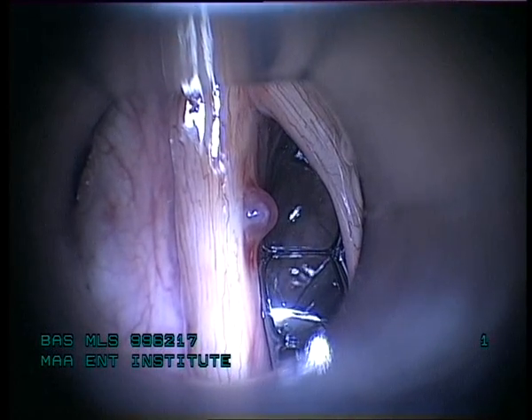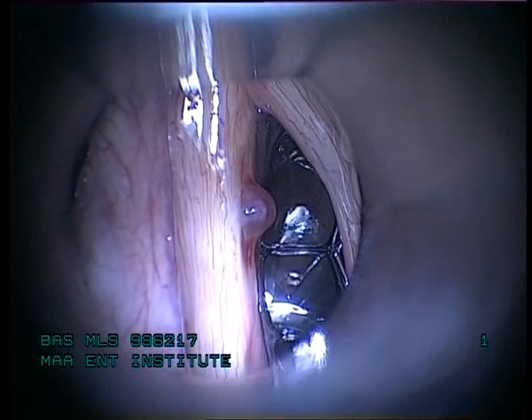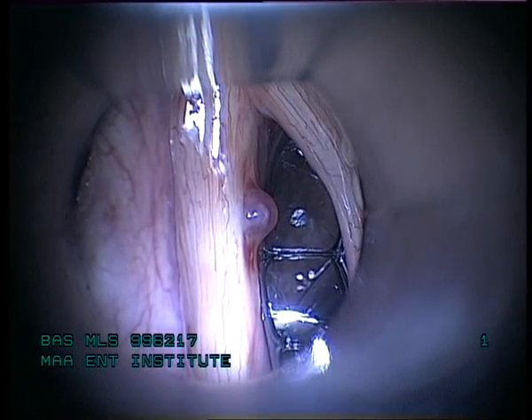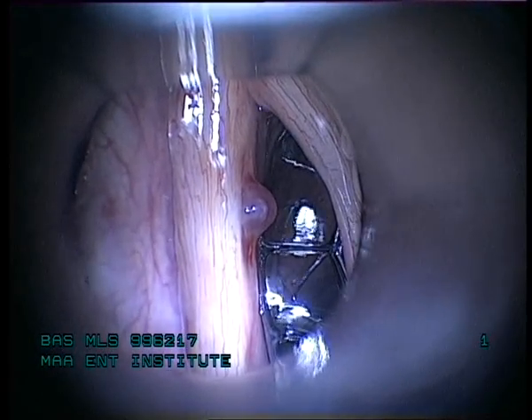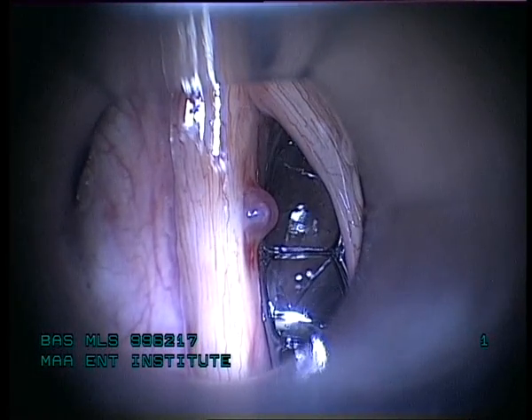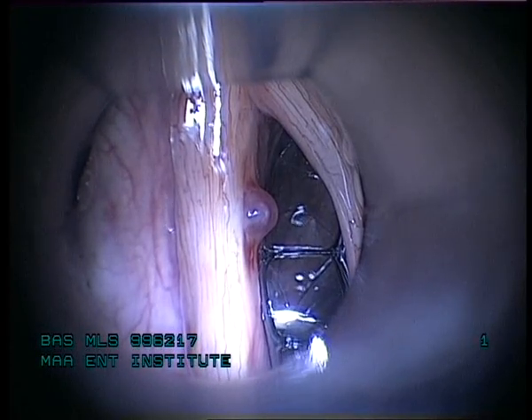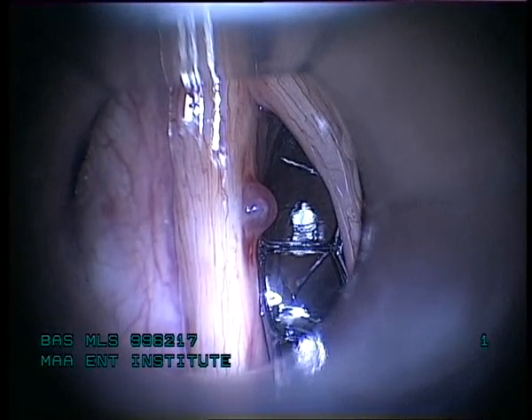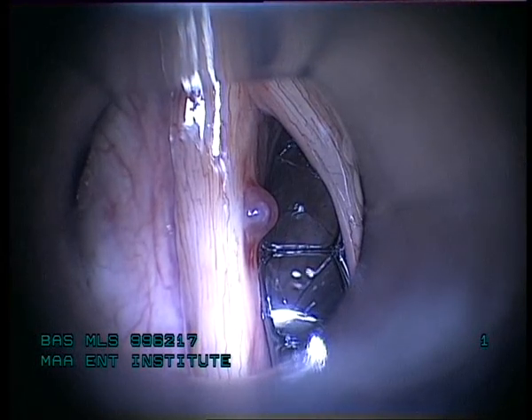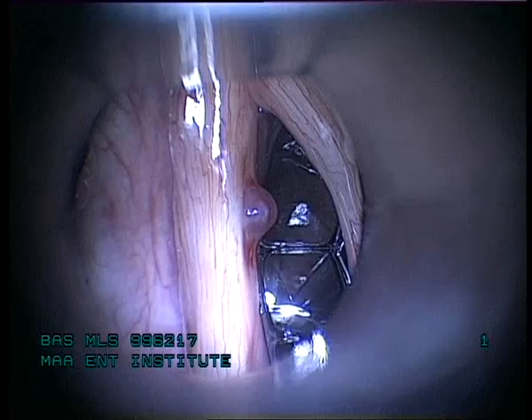You can see the telangiectic polyp on the left vocal cord in the anterior one-third, very close to the anterior commissure. This looks like a telangiectic polyp arising from the left vocal cord middle edge, middle border.